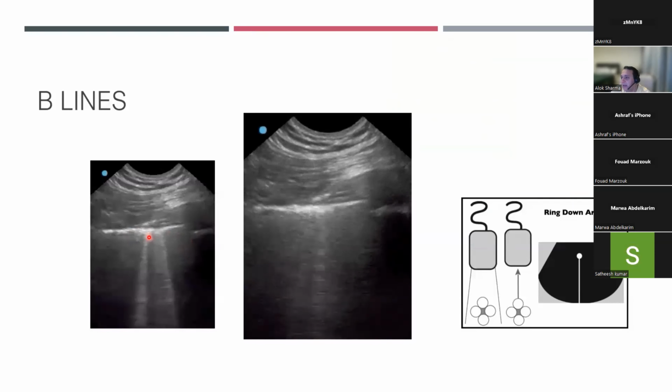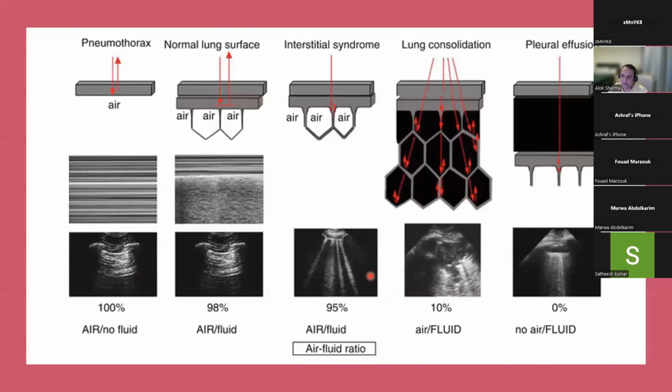So here you've got B lines, you've got pleural sliding, but you've got these B lines. But what has happened is the alveoli are also full of fluid. So because of that, you see no aeration, you see no A lines. Now, theoretically, B lines will break A lines, but it's very theoretical. And depending on aeration of the lung, you can have various levels of interaction. And that is reflected here.